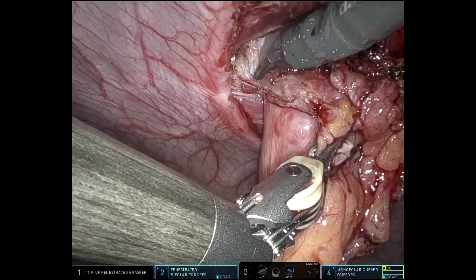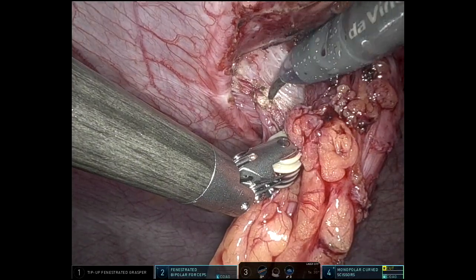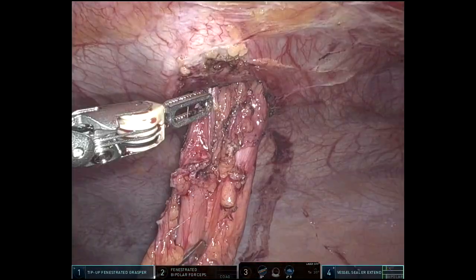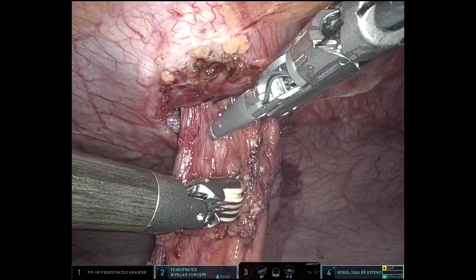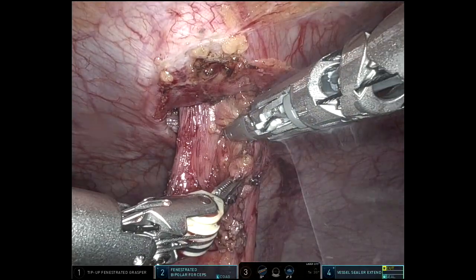I did have to mobilize the splenic flexure, and she had a good amount of scarring up there. I felt like my most cephalad 8-millimeter port would have been more helpful if I had made it more lateral on the patient's right side, maybe coming underneath the falciform ligament instead of on the patient's left side of the falciform — but live and learn.